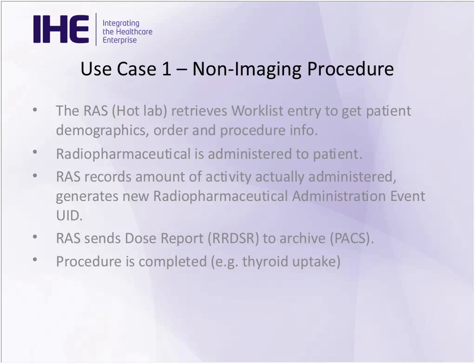So the radiopharmaceutical is administered to the patient. Typically, these are diagnostic, but they can be therapeutic or both, and we can note that at the top of the RRDs. I think we can just go to the next one. We'll go through the workflow real quick.